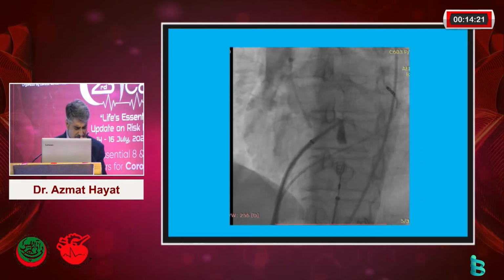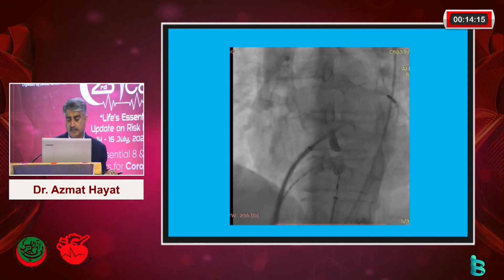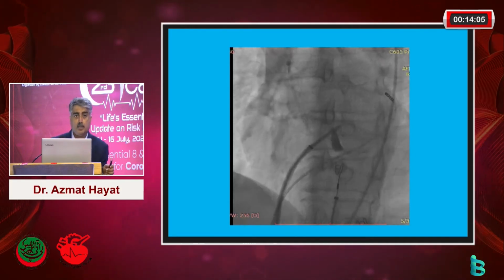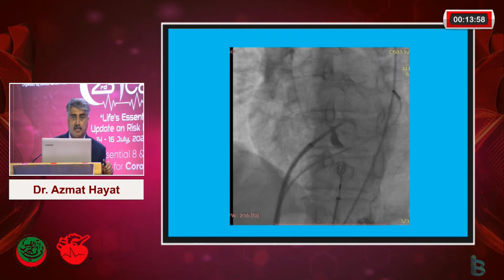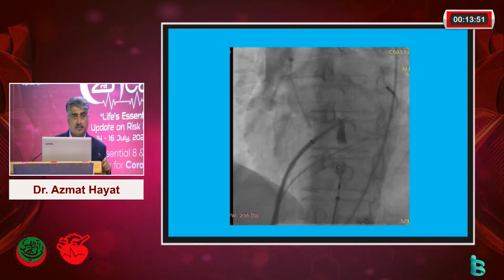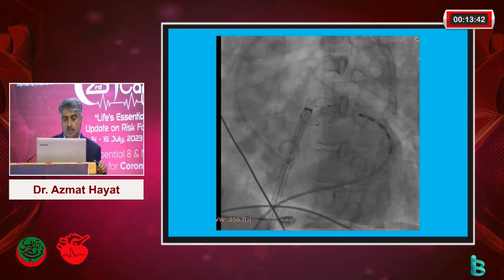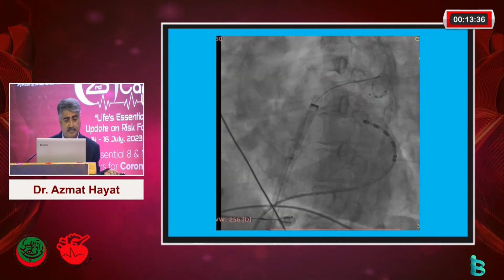As you can see, this is the standard approach. The only difference with us, the electrophysiologists, is that we have the skills to hit the fossa quadrant by quadrant. If I want to go to a quadrant, I can go by design, and similarly the anterior inferior quadrant. Because the gadgetry is quite bulky in the left atrium, the right quadrant is very important to gain access to. Here you can see an achieved catheter.